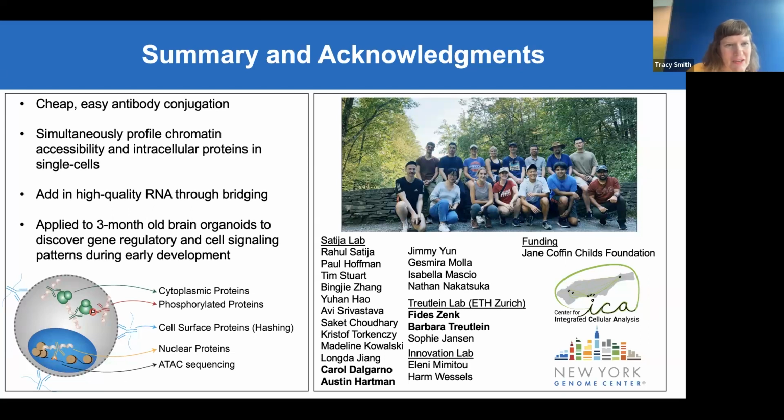Another question. How is the relative protein abundance estimated? Is the binding efficiency of the different antibodies taken into account? That's a great question. With this assay, it's very hard to estimate the binding efficiency of the antibodies. Every single antibody is different, and within this assay you have antibodies that work really well and antibodies that don't.